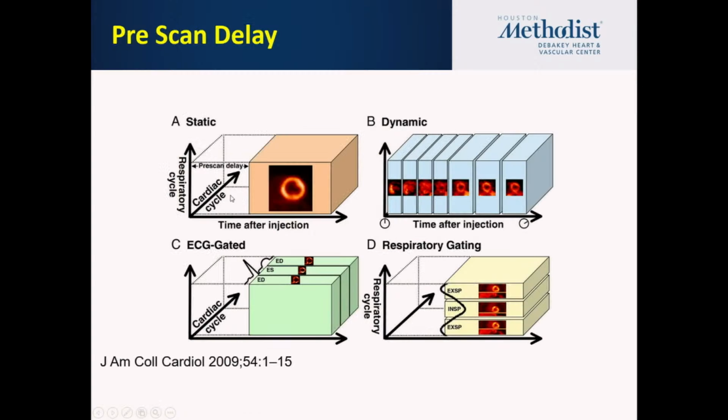So in summary, we will get multiple sets of images. In SPECT, you're primarily getting the ungated and gated images. With PET, you're going to get the ungated or static, and the gated imaging, same principle as SPECT, but now we're adding the dynamic. And the dynamic takes into account the time from injection all the way to later on.